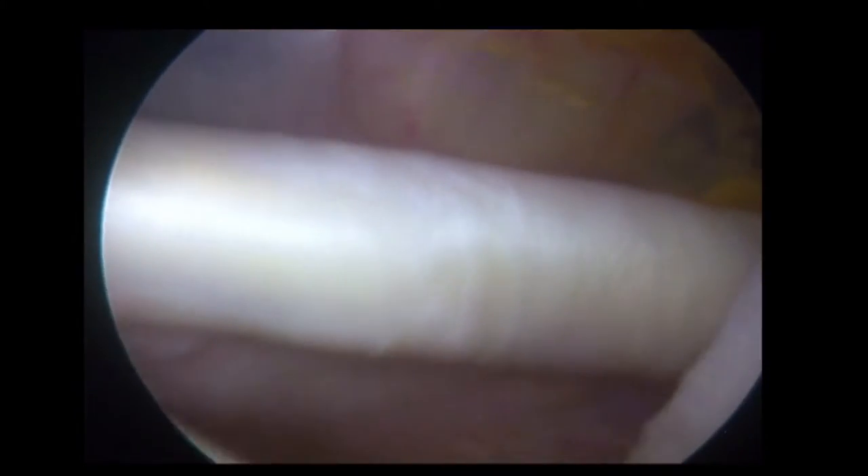This is the superior edge of subscapularis, and by rotating the scope medially we can watch it as it passes medially. Looking inferiorly and internally rotating the shoulder, we take some of the tension off and we can see the anterior part of the glenoid where Bankart tears occur and the inferior part of the joint. Bringing the scope up superiorly and rotating it out laterally, we can see the undersurface of the cuff — this is supraspinatus and the rotator cable.